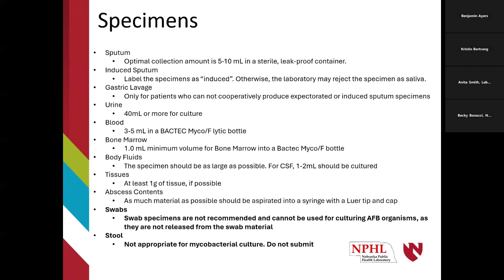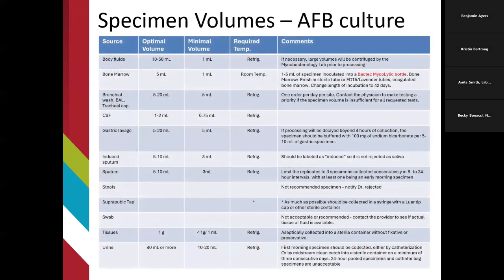Stool samples have an enormous amount of bacterial overload, so please do not ever submit those. This slide gives the quantities we usually recommend.